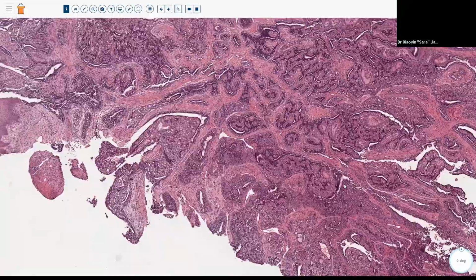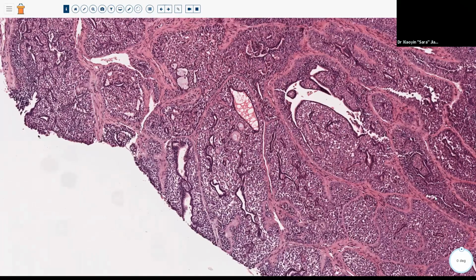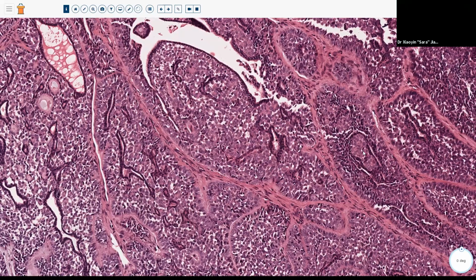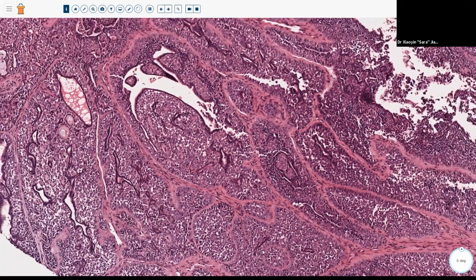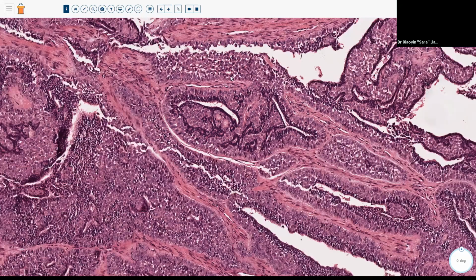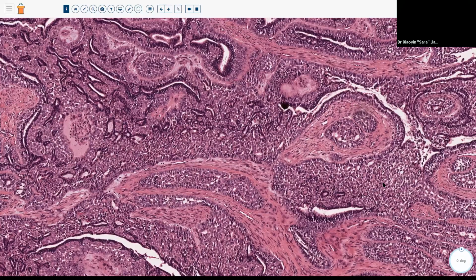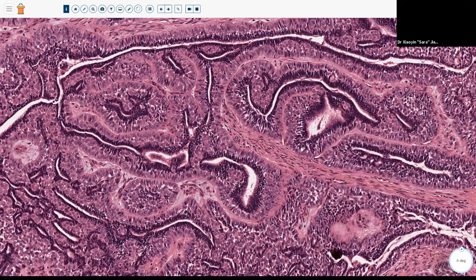The next step, of course, is to see what cell type is making up this tumor. And as we look, we can see that there's a couple of different cell types, maybe kind of an inner epithelial component, and then this more kind of clear or myoepithelial appearing component. Let's see if we can find a more classic area. So here we have kind of a nice dual layer of an epithelial and then myoepithelial cells. And some areas have a little bit more of that myoepithelial or kind of clear cell look. So I have just described, of course, epithelial myoepithelial carcinoma.